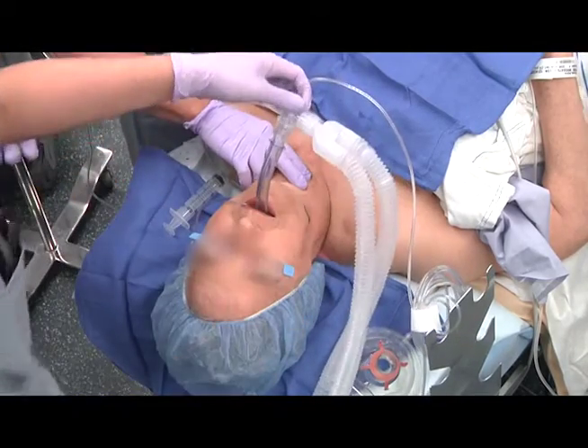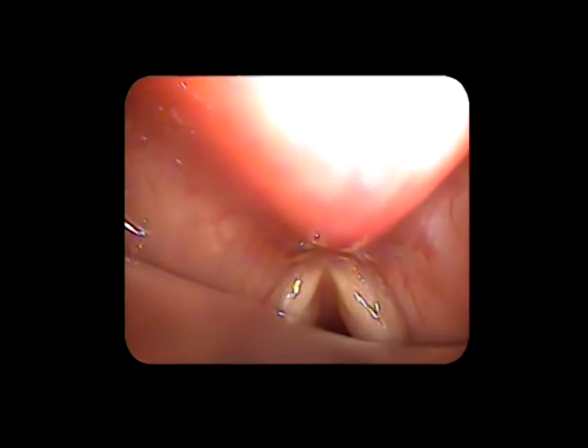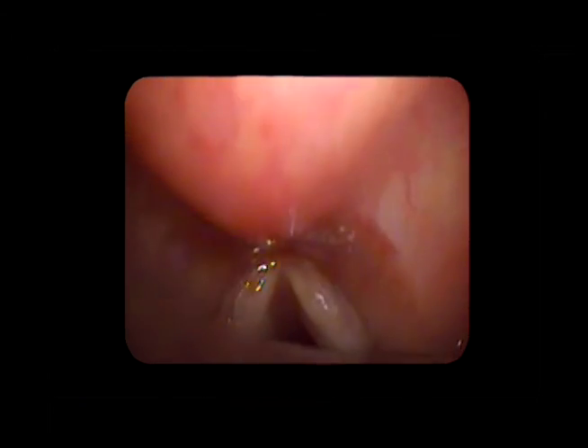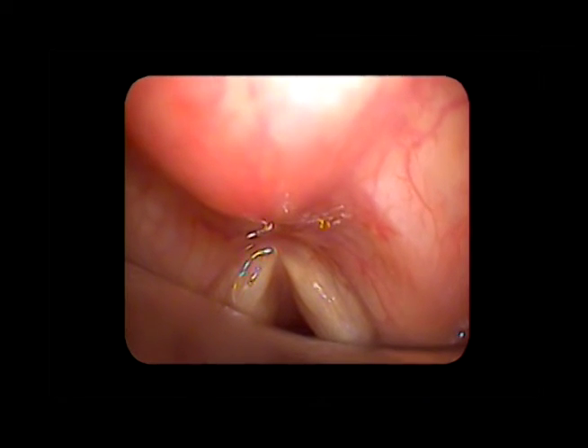The operators decided to use a flexible intubation scope to examine the position of the LMA. Here we see that the distal end of the LMA has not passed below the larynx under the cricoid cartilage, but is actually sitting within the vocal folds. This laryngeal mask airway was removed and reinserted. There was no leak appreciated and inspection revealed a very good placement.